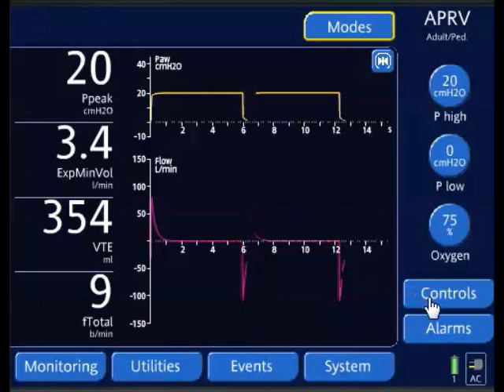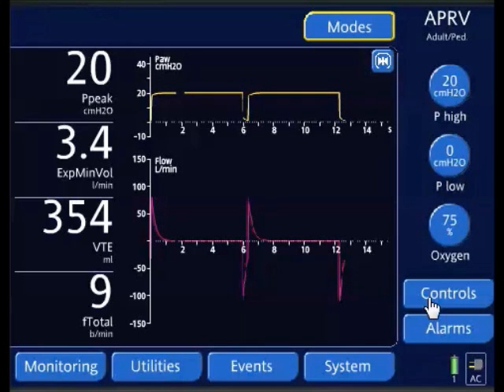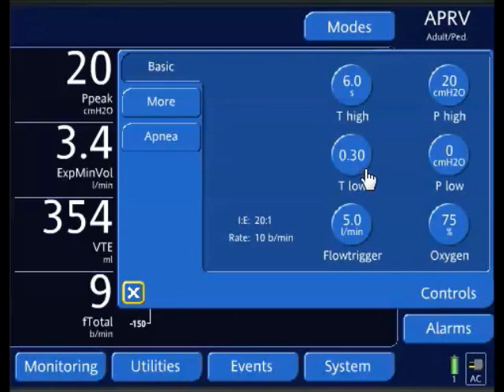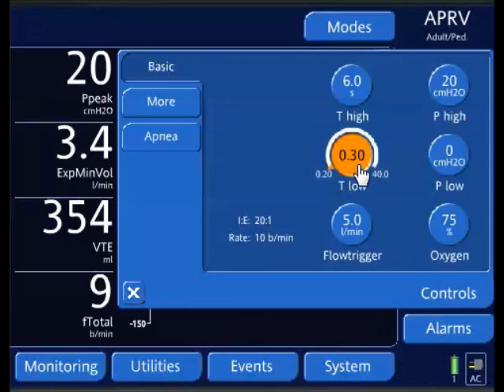This is the easiest way. In Hamilton ventilators, they measure the respiratory time constant. You can do this in a Servo-i ventilator also, or you can take the resistance and compliance measurements and calculate the time constant yourself. Note this is usually an inspiratory time constant, not an expiratory time constant. So under controls, I can just change my T-low to 0.8.